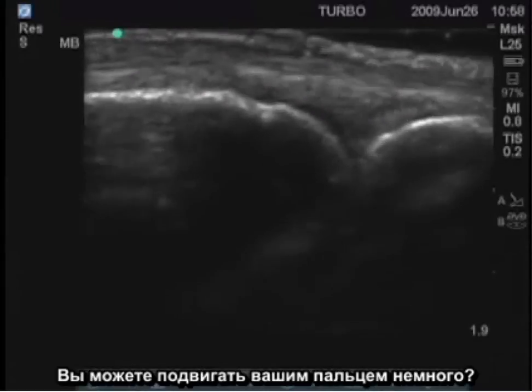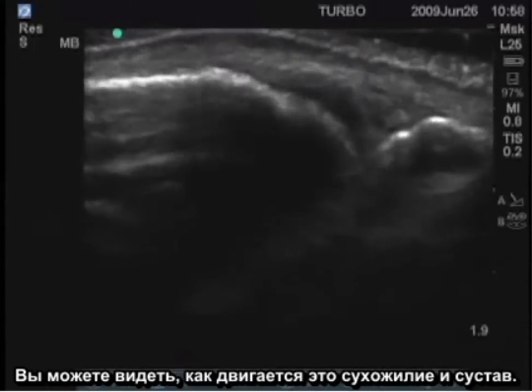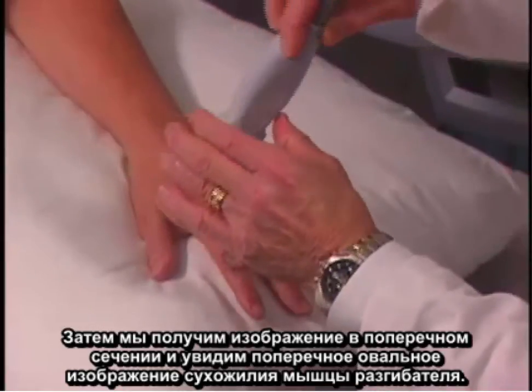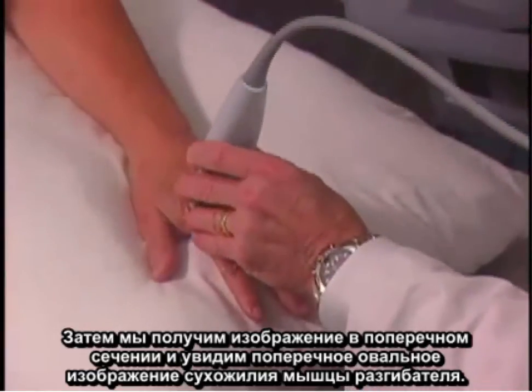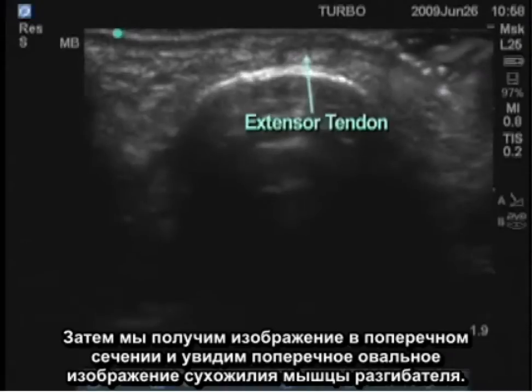You can see that tendon moving and the joint moving as the finger is moved. We'll then take a transverse image and see a transverse oval image of that extensor tendon.